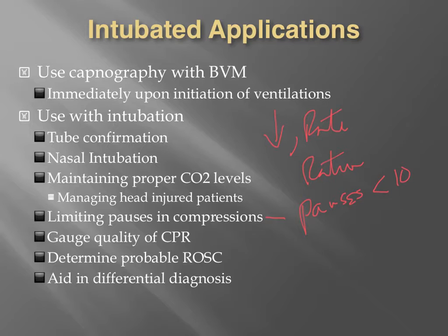If we're getting a really, really low end tidal reading, well, remember, capnography in combination is ventilation, perfusion, and metabolism. We need to have all three present, and then based on what we're doing with this patient, we can maybe help navigate through the waters to decide whether or not this patient has a perfusion issue, a ventilation issue, a metabolism issue, or all of the above.